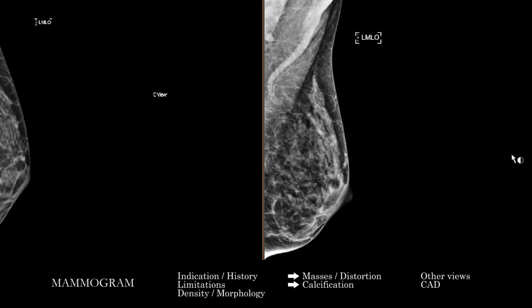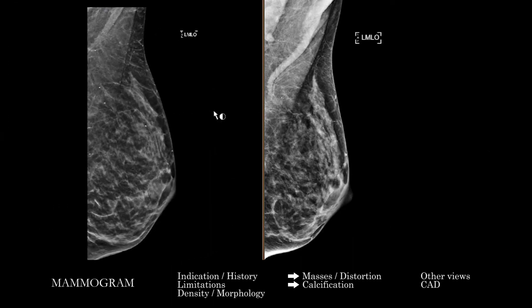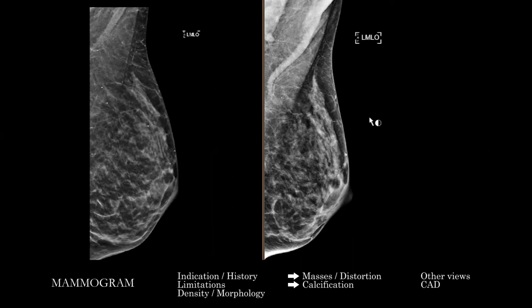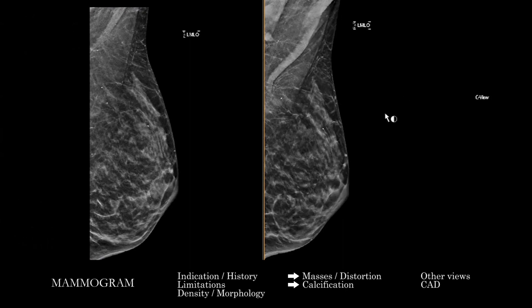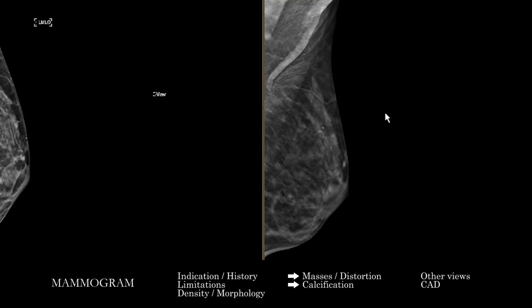That was the right breast, and then we're going to repeat the same sort of approach for the left breast.